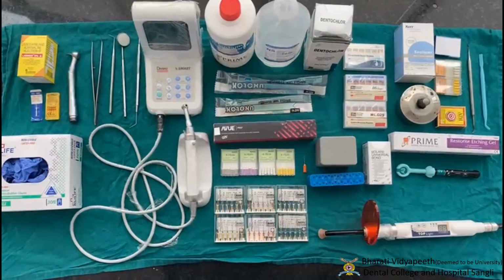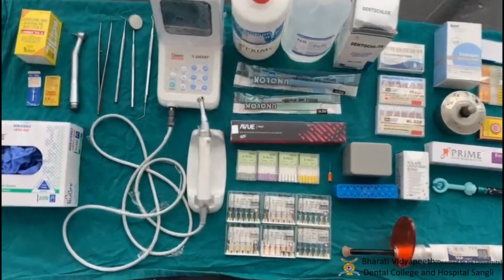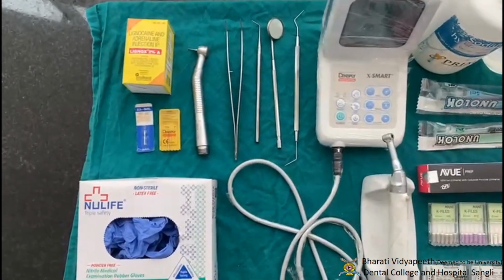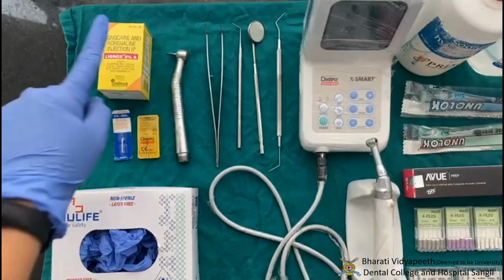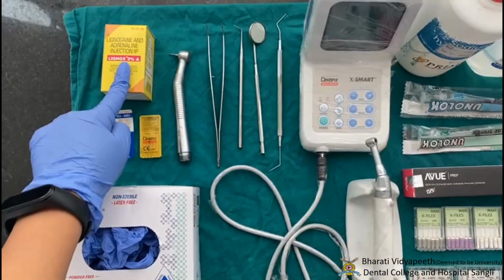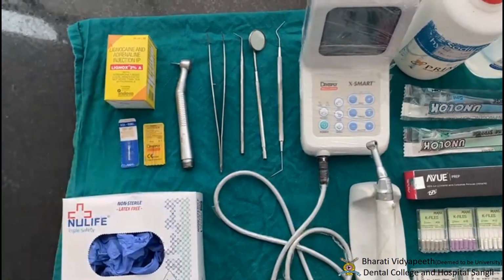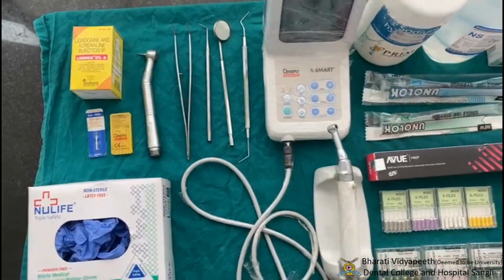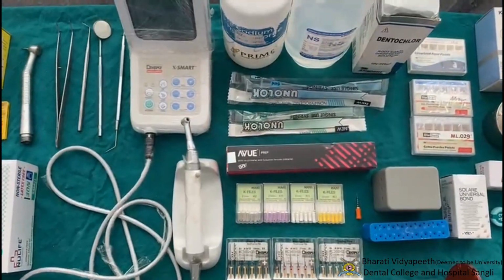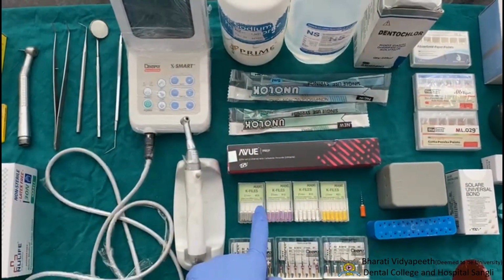Before starting the root canal treatment, let's have a look at the armamentarium required. These are the materials required for the access cavity preparation. First, local anesthesia is administered. Then, with the help of an air rotor, round safe-end, and endo-access bur, an access cavity is prepared, followed by which the working length is determined and the pulp is extirpated with the help of hand files.